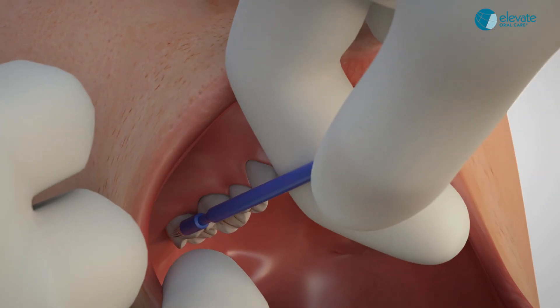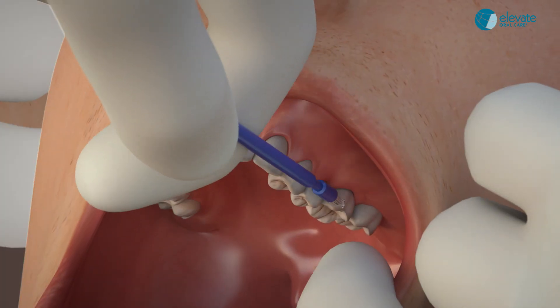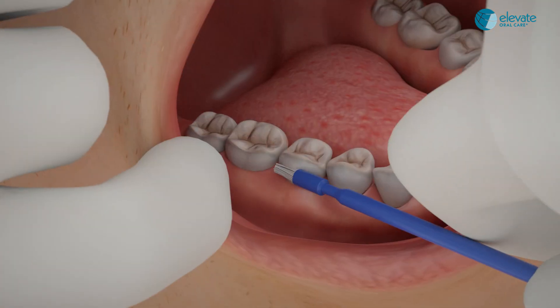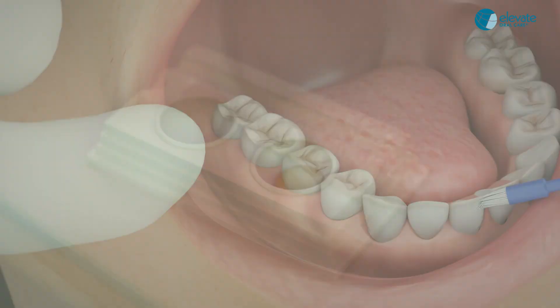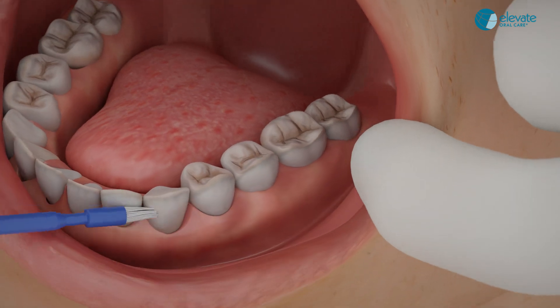Paint one quick swipe on the facial surfaces of each quadrant in one sweeping motion. Do not cover each surface meticulously or repeat coverage over the same surface twice. Re-wet the brush after each arch or one half of the mouth as needed.